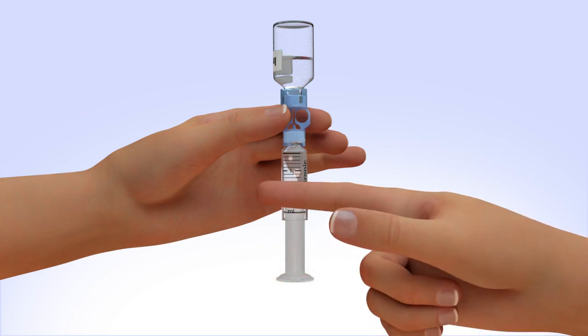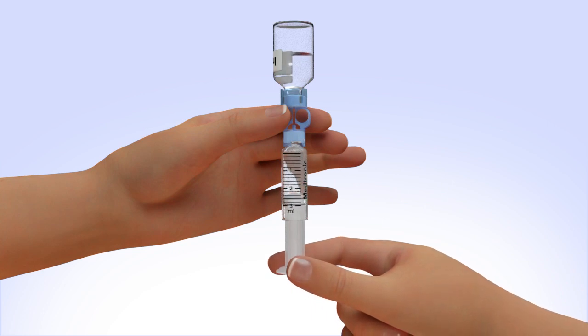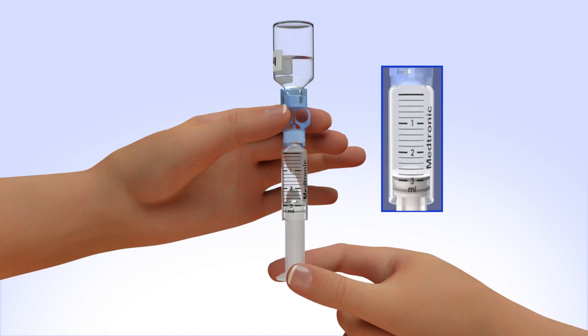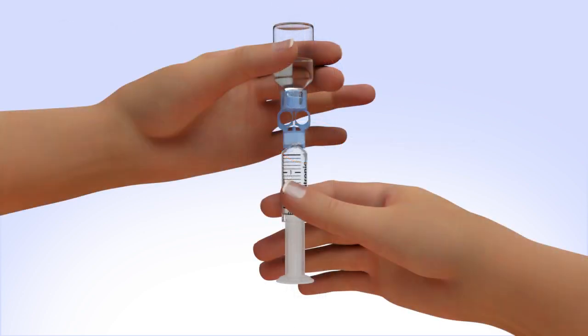Tap the reservoir hard enough to make the air bubbles rise to the top. Slowly push up on the plunger rod to move the air bubbles back into the insulin vial. Pull down on the plunger to fill the reservoir to the number of units desired. Repeat as needed until air bubbles are removed from the reservoir. Look in the window of the blue transfer guard to make sure no air bubbles remain.